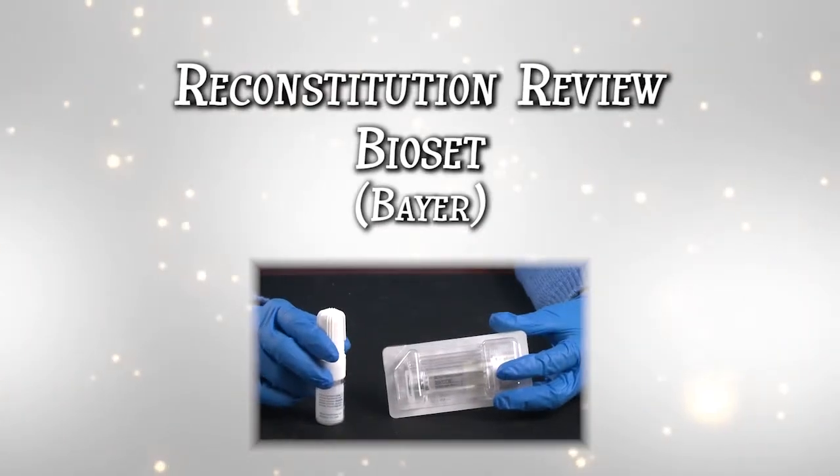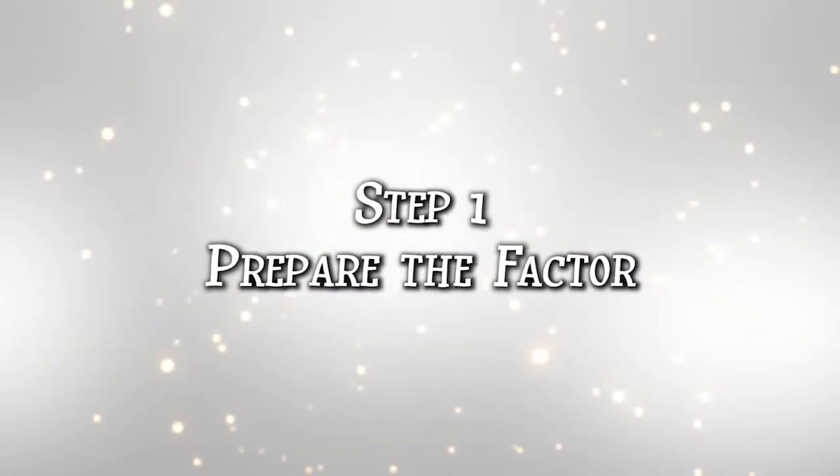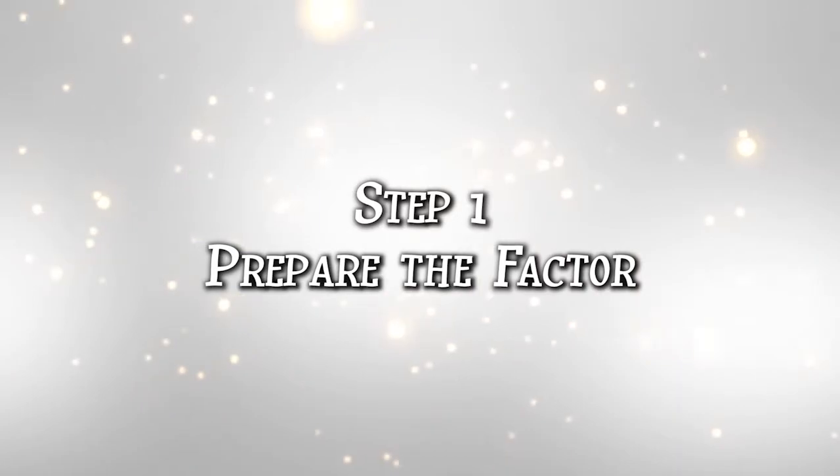Welcome to Reconstitution Review with BioSet, which can be used with Bayer products. You're going to prepare, activate, and transfer your factor.